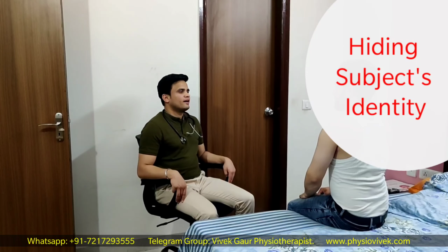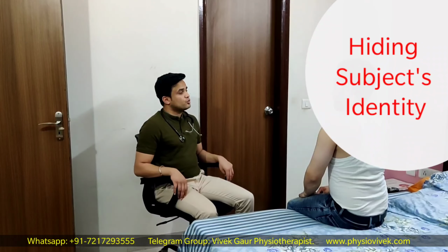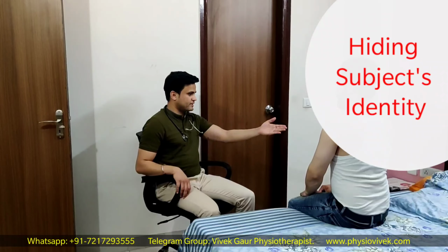Hello. Hi. I will be auscultating your heart today and the surrounding area. Okay. Do I have your permission? Yeah, sure. Please lie down.